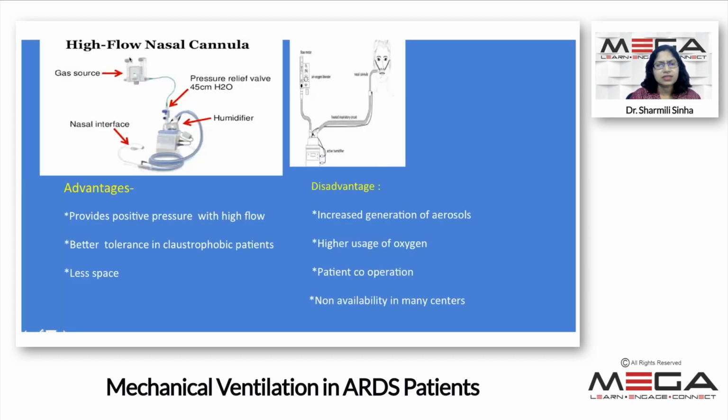Now, what about this HFNC? I think most of you are familiar with this. Just quickly talking about it, it is user friendly. We have a gas source. This is an active humidifier, and there is an admixture of gas and oxygen, and it is attached to the patient with a nasal interface, as you can see here.